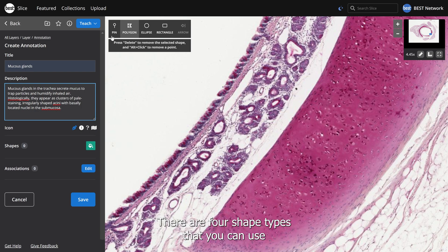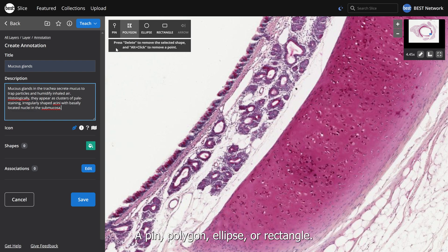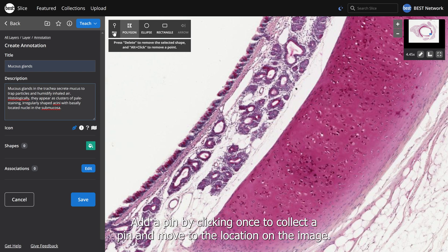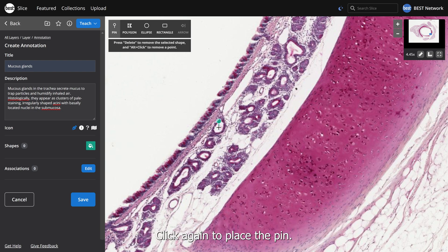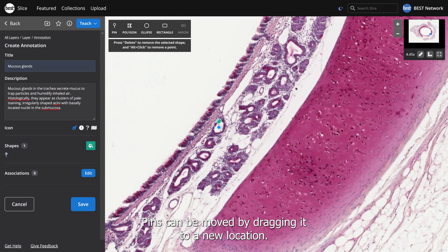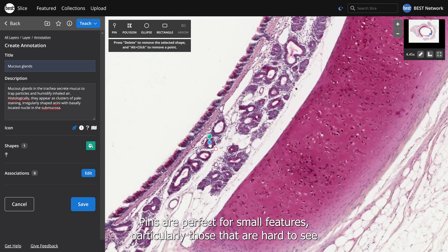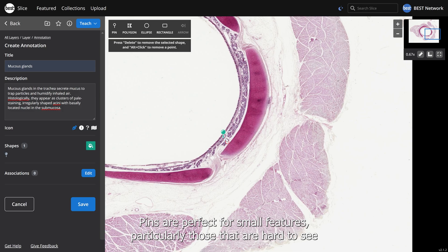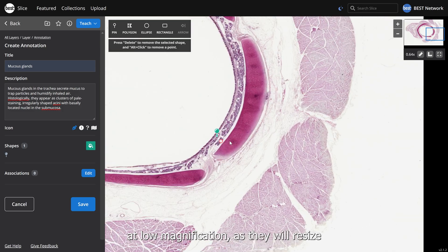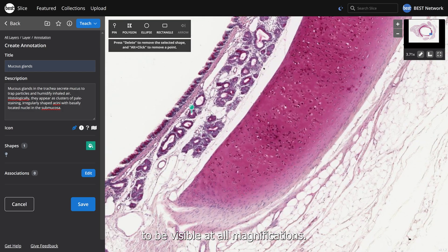There are four shape types you can use to mark out the feature's location on the slide: a pin, polygon, ellipse, or rectangle. Add a pin by clicking once to collect a pin and move to the location on the image, then click again to place it. Pins can be moved by dragging to a new location. Pins are perfect for small features, particularly those hard to see at low magnification, as they will resize to be visible at all magnifications.